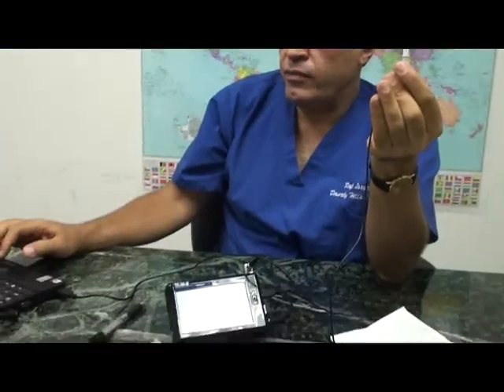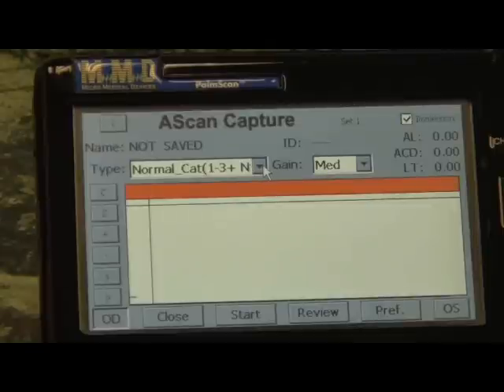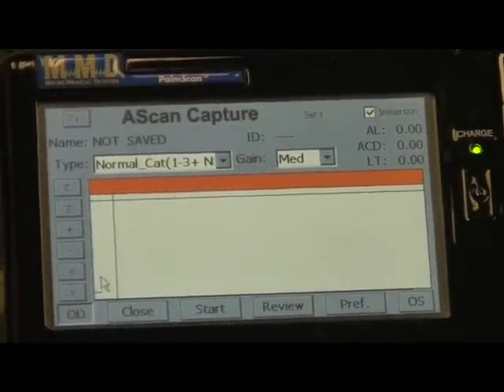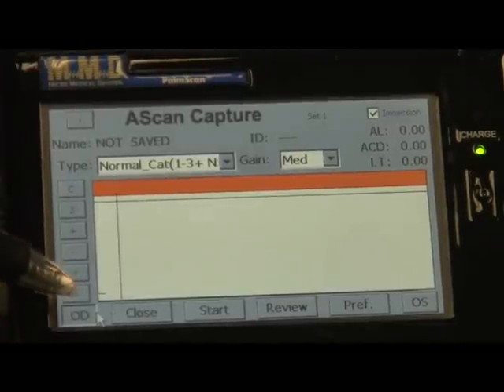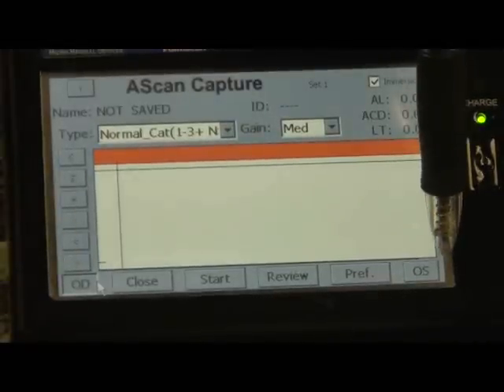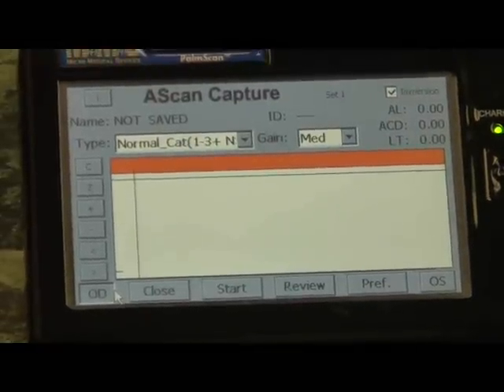When you're ready to scan the patient, first make sure the machine is set on immersion. For a normal cataract — which is 99% of patients — I will start with the normal cataract eye type. The right and left eye are selected on screen; right now OD is selected, and you can select OS by pressing the OS button on the lower left-hand side of the screen.